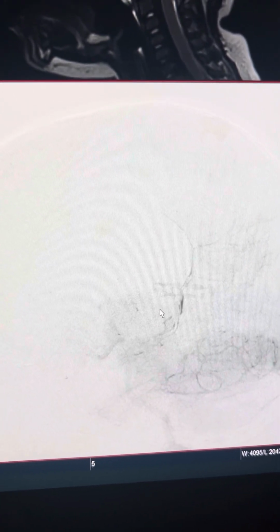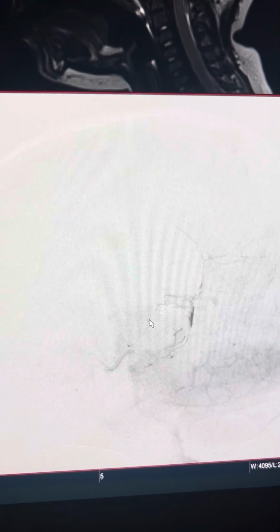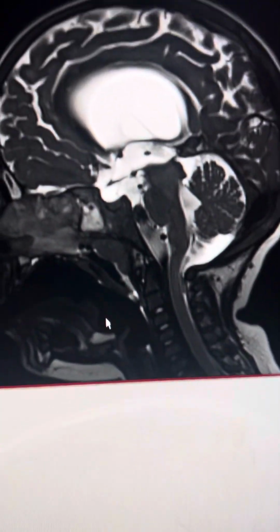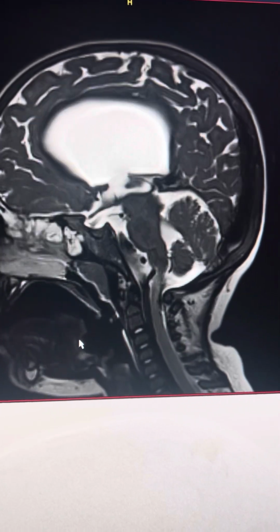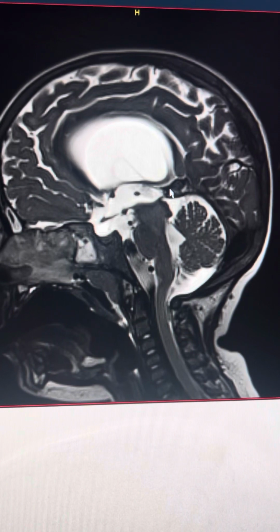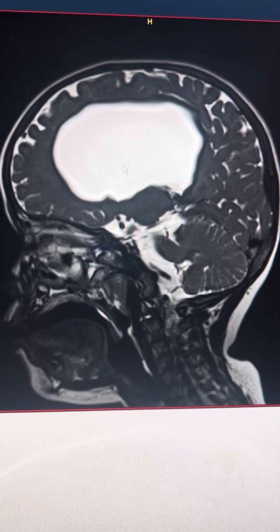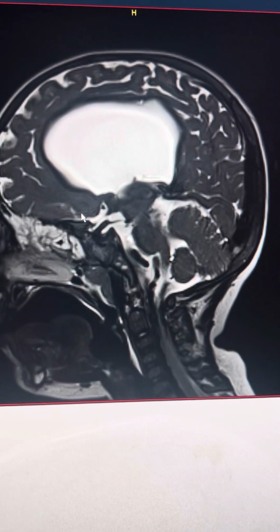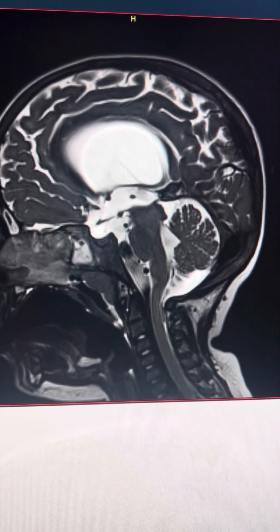about in 2019, and then the patient came back for follow-up, several MRI examinations, latest now in 2022. Actually, this is MRI brain, which is showing where this whole vein of Galen is basically gone. All the mass effect has disappeared. You still see some dilated ventricles, but there's no active hydrocephalus, which is an excellent result.